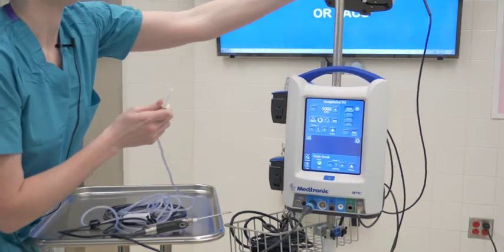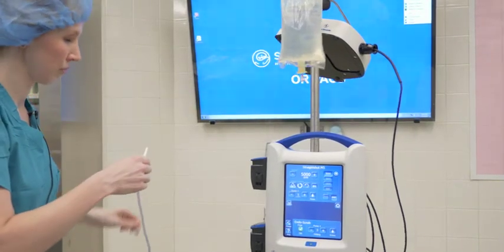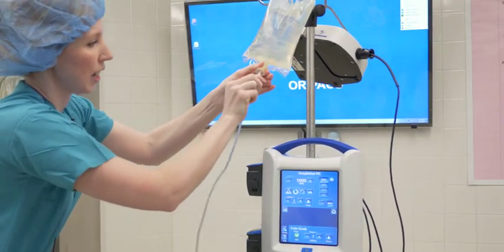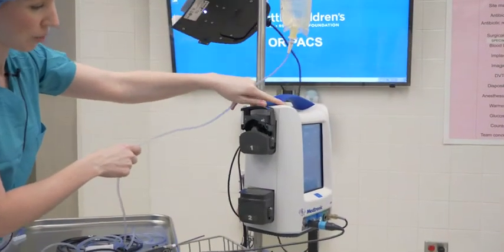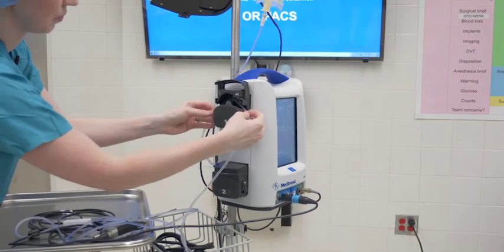So we just have a 500 ml bag of saline. Spike the bag. And then pop this open and thread it through here.